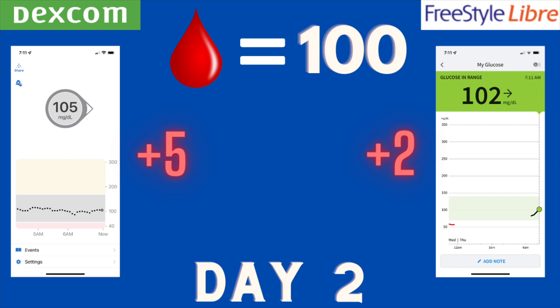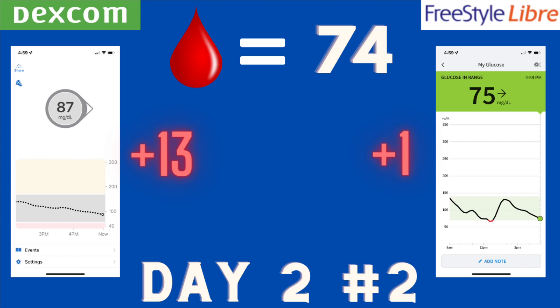I did a second finger stick on some days when there were fluctuations in my blood sugar. Later on day two, I felt like I was trending lower — maybe heading toward hypoglycemia. Finger stick was 74. Dexcom was reading a little higher at 87, off by 13. The Libre was very, very close at 75, only off by one point. The Libre was definitely much more accurate in this situation.